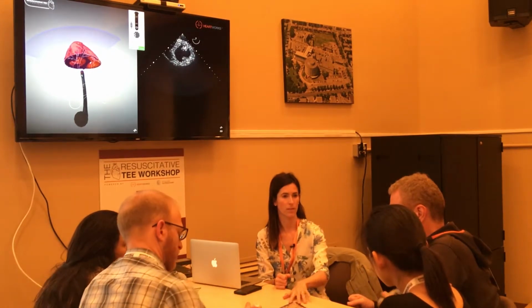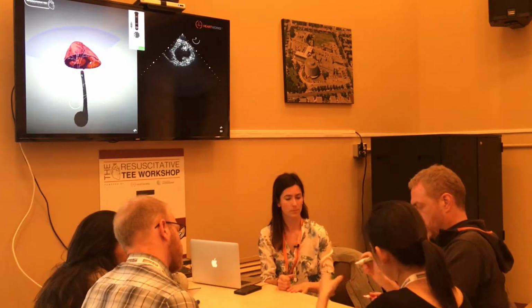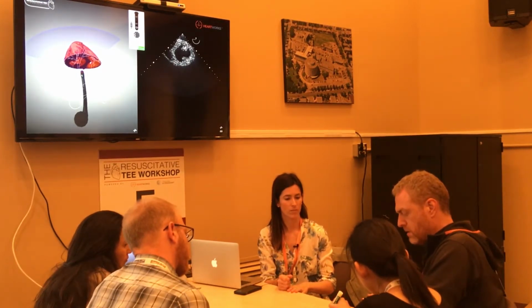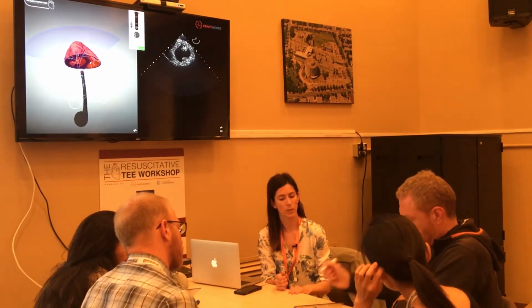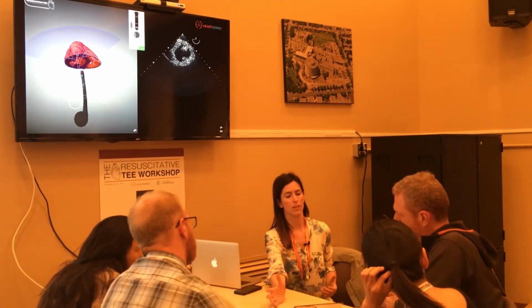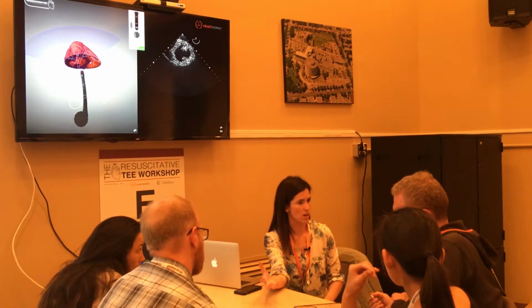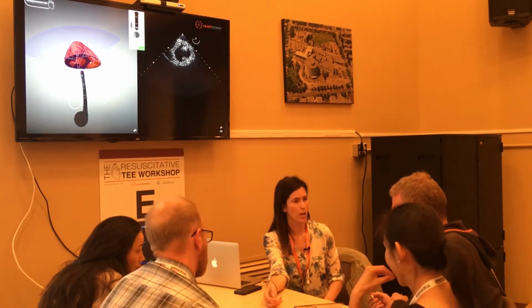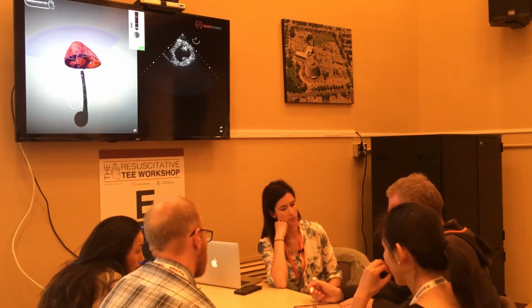You got it. Lateral wall. Yep, and then septal. Great. Now, can you tell me if I had a myocardial infarction that involved the left anterior descending artery, where would I have wall motion abnormalities on this particular view?